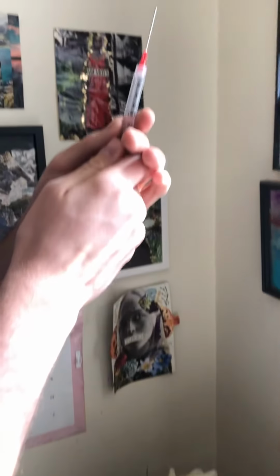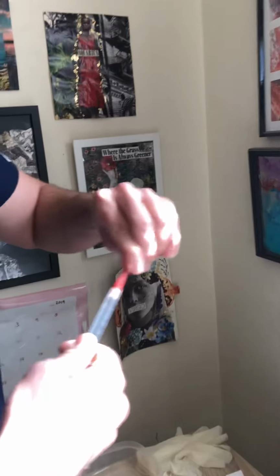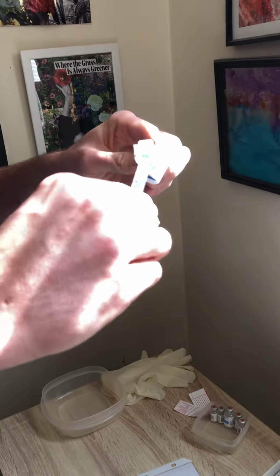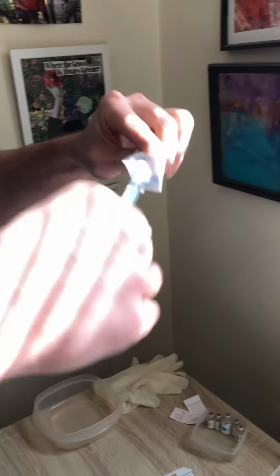And then we'll pull back, make sure there's none in the needle itself. Then we're going to cap that. And because I've already pulled it back, I can remove this. That'd go into my sharps container. We'll just say that's my sharps container. And we're going to butterfly these back to maintain sterility, and put that in the garbage.